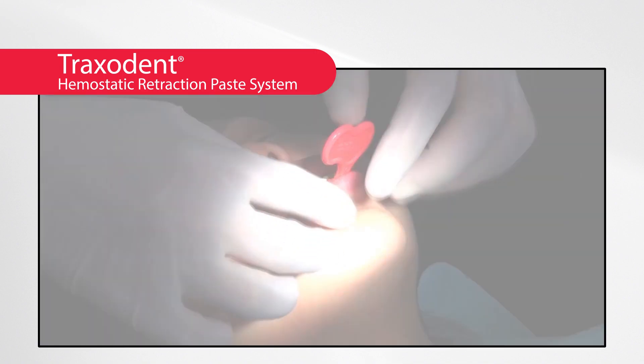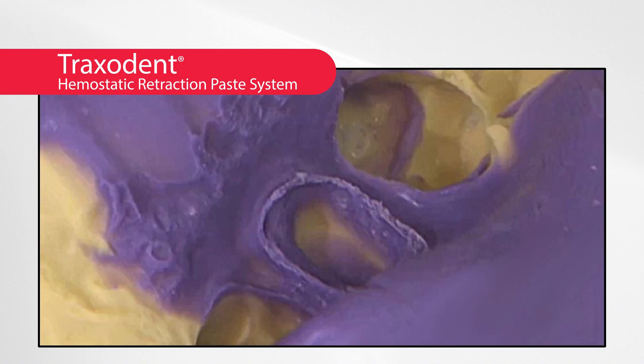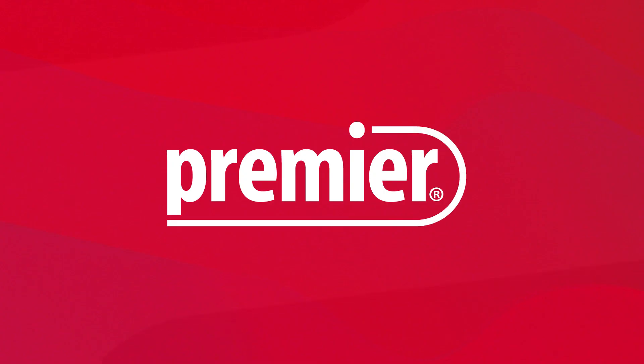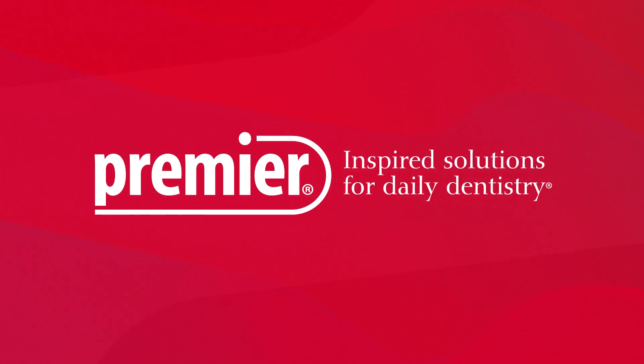Proper preparation, the use of Traxodent retraction paste, and good impression making technique all contribute to a perfect impression. Every time. Premier Dental.